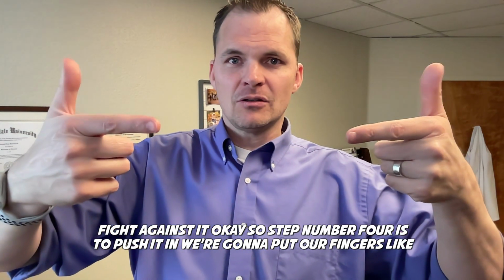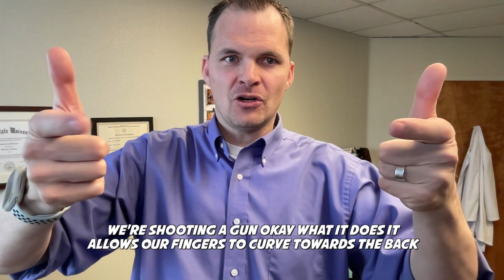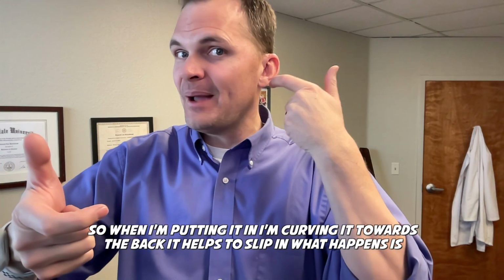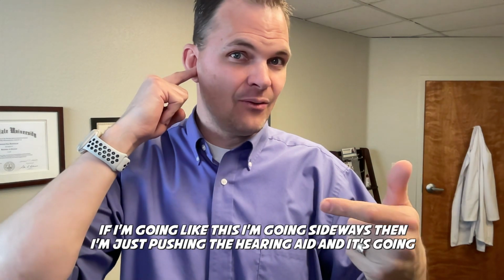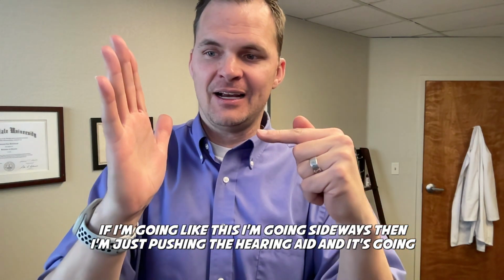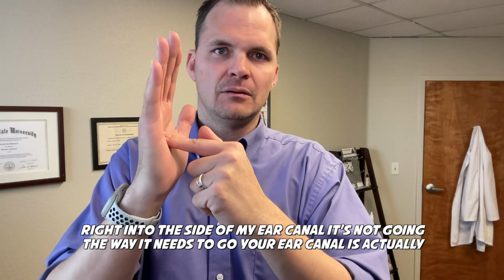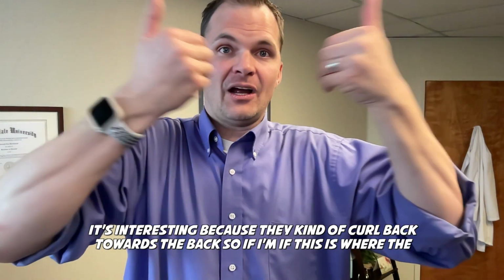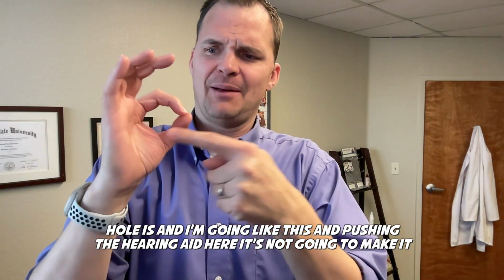We're going to put our fingers like we're shooting a gun. Okay? What it does, it allows our fingers to curve towards the back. So when I'm putting it in and I'm curving it towards the back, it helps it slip in. What happens is if I'm going like this, I'm going sideways, then I'm just pushing the hearing aid right into the side of my ear canal. It's not going the way it needs to go. Your ear canals actually, it's interesting because they kind of curl back towards the back. So if this is where the hole is and I'm going like this and pushing the hearing aid here, it's not going to make it.